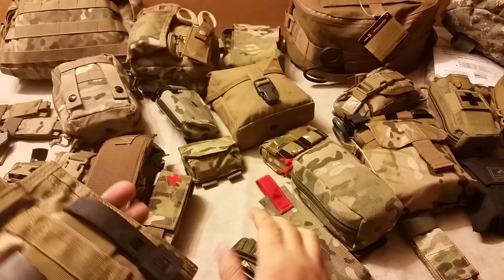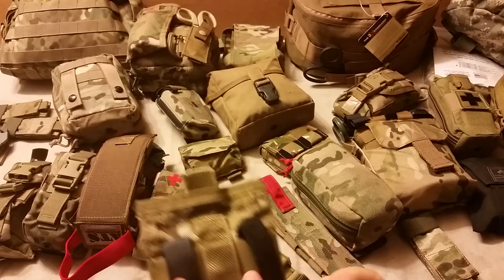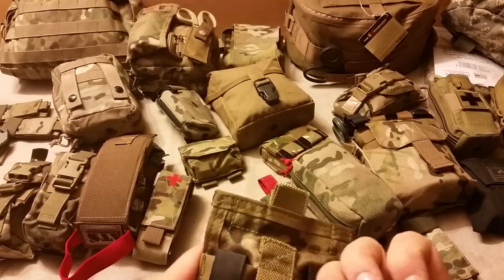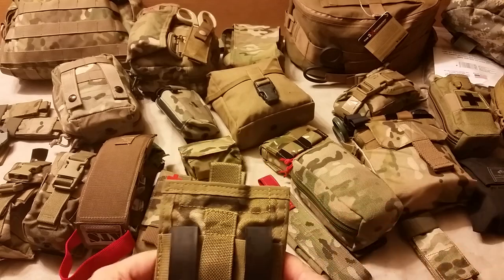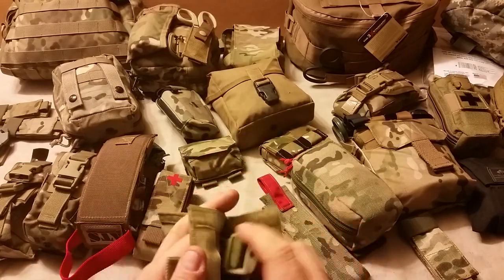You can use the MALICE clips or Alice clips, or you could use some other type of attachment. You've also got just a loop there so you can put it on other gear through the shoulder strap of something — it really lends itself to being available where you need it. The tourniquet fits right in.